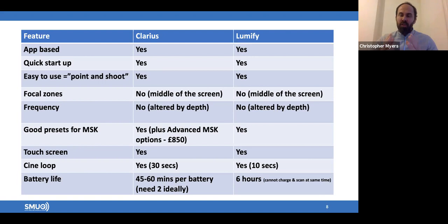And the key thing you've got to remember, and I just kept noticing that the battery just kept running out really quickly. I'd put it down, see another patient, not use it for 30 minutes, or 45 minutes, I go back, and the battery will be dead. And the reason being is that you have to freeze, or you have to press one of the buttons on the Clarius to basically switch it off and put it into low power, the power save side of things. So that means that you will actually keep more of your battery. The important thing is not to put it down and forget about it, because that battery is still being used, and then you pick it back up and it will be dead.